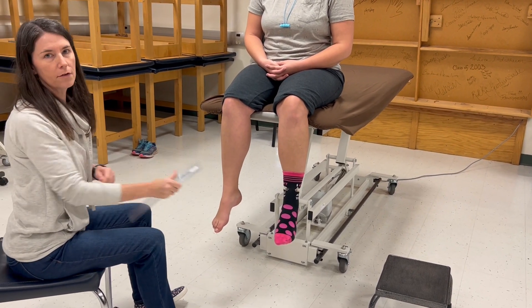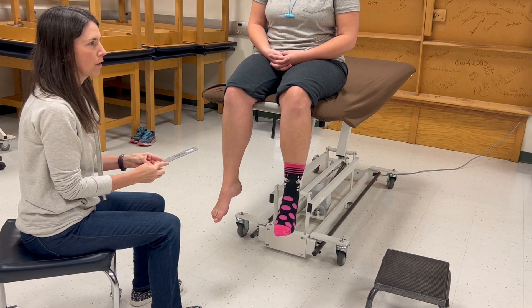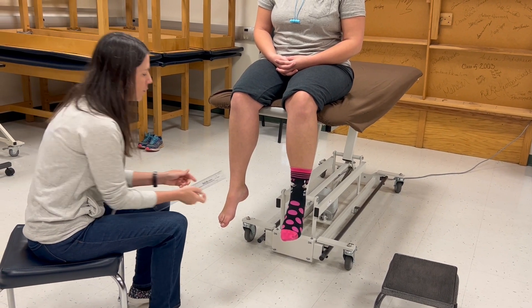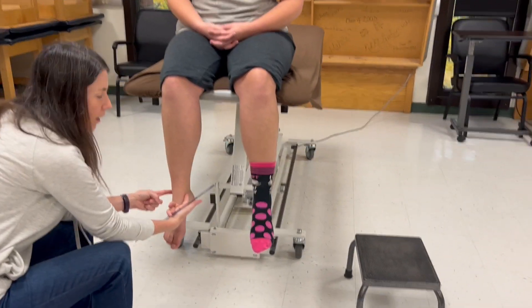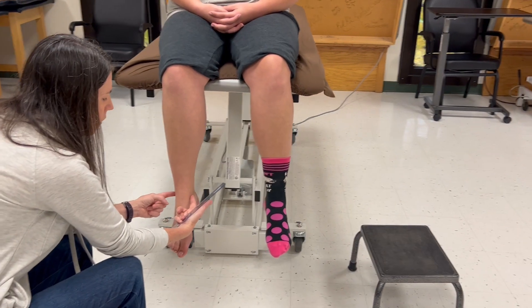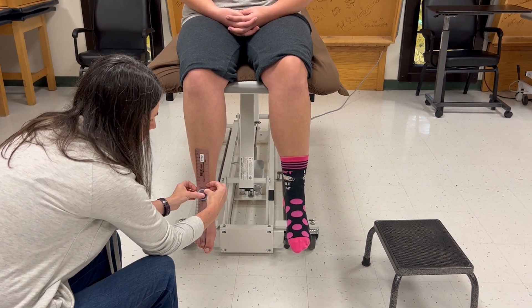The alignment of the goniometer fulcrum is the same for inversion and eversion. The fulcrum is going to go anteriorly, midway between the two malleoli. I'm palpating the medial and lateral malleolus, coming around anteriorly, and right in the center is where I'm going to place the fulcrum.